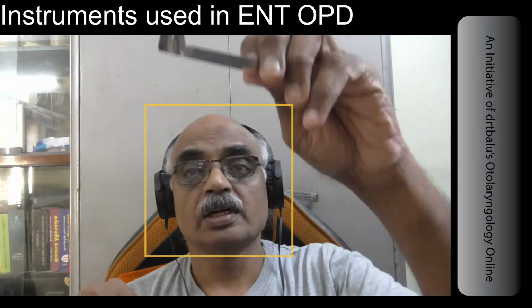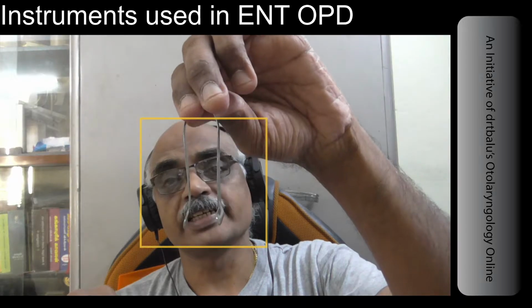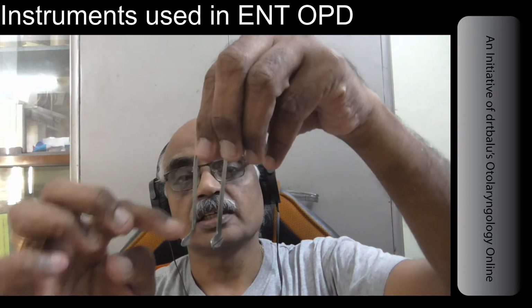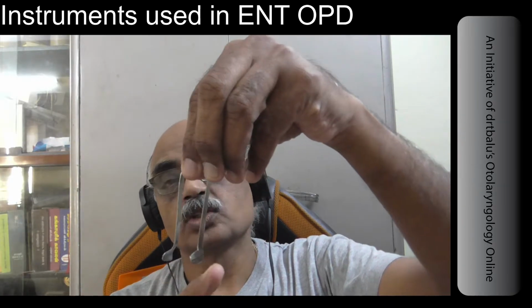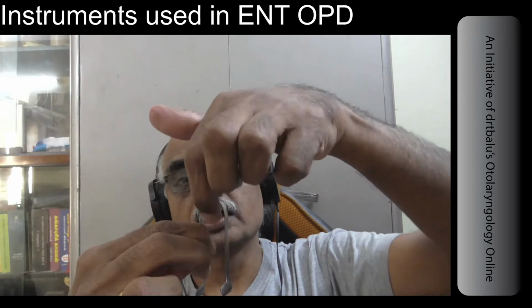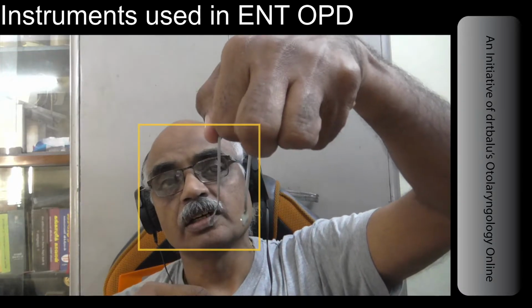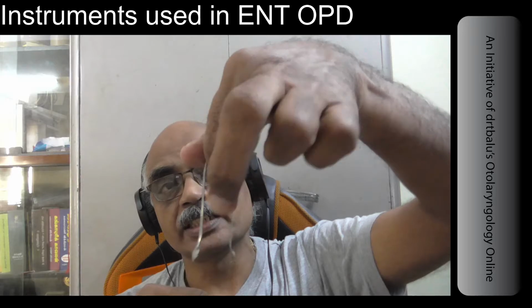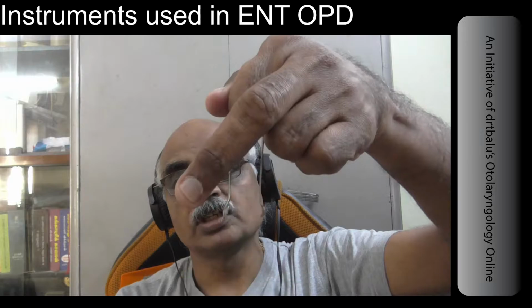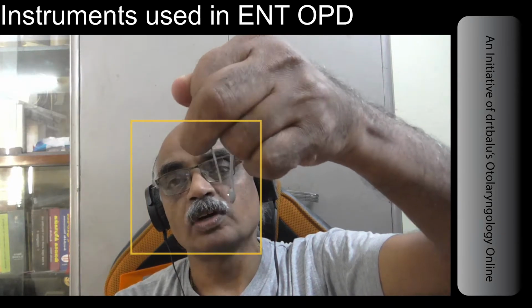The next instrument I'm going to show you is a 150-year-old instrument. It's actually a Thudichum's nasal speculum. This speculum is ideally held in the non-dominant hand. It has two vertical limbs and two horizontal limbs, and these limbs are joined by a curved shoulder. You hold the speculum like this by hooking the index finger over the shoulder, stabilizing the left limb of the Thudichum speculum with your ring finger, and then using the middle finger to compress. This is how you operate.